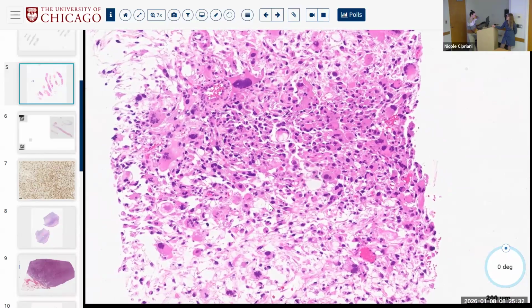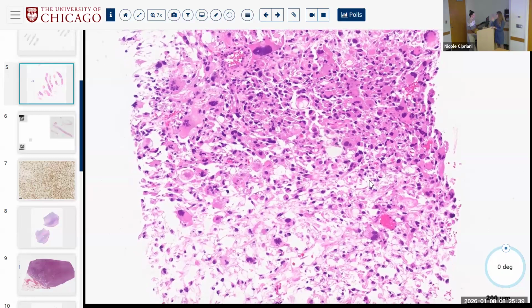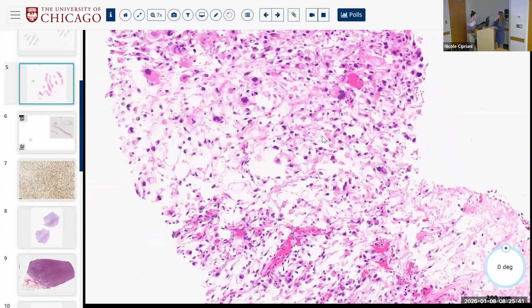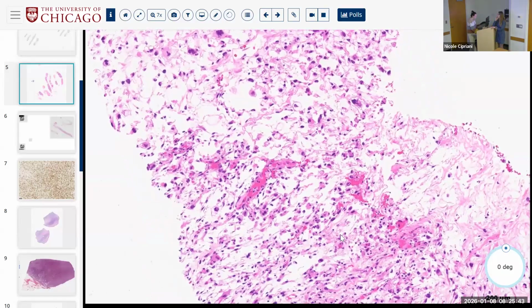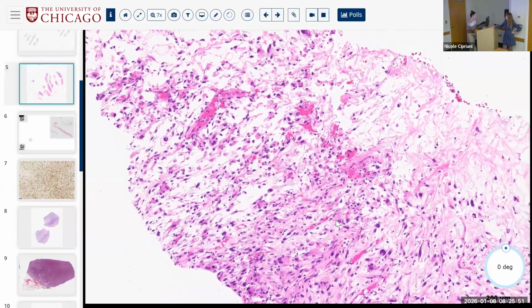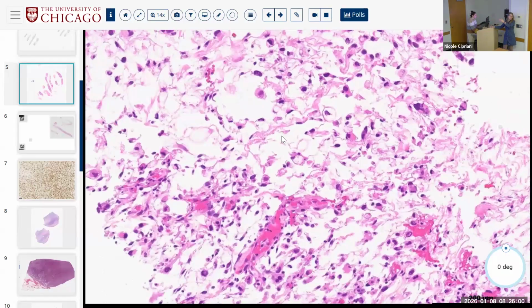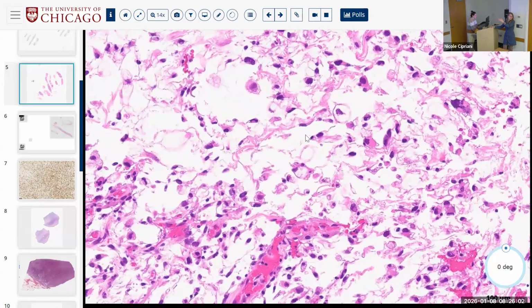Okay, so now we are with a pleomorphic spindle cell neoplasm in an adult. Now I'm going to point you to these paucicellular areas. When you see these paucicellular areas with this wispy material, what do you think about? Not carrot-shaped, you're not thinking about a neurofibroma. This is an outside consult, so the staining is a little bit not what we are used to, but what kind of stroma do you think is going on here in the background?